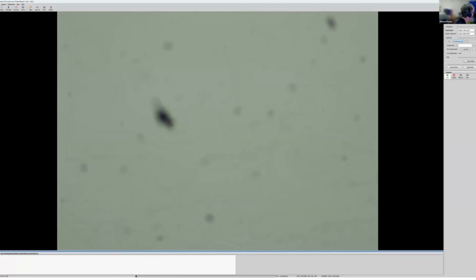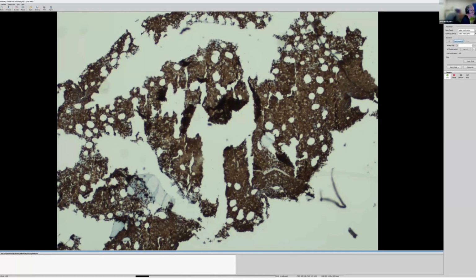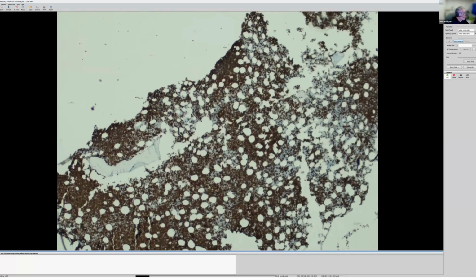That's the control. If I can find the thing there. So really, really heavy infiltrate all the way through. I thought maybe 80% of the cells. Okay, that's a good point. Natasha's query: I don't think it's Richter's transformation, because where you get that, you get sheets of blasts, but they could well be pro-lymphocytes. Yeah.